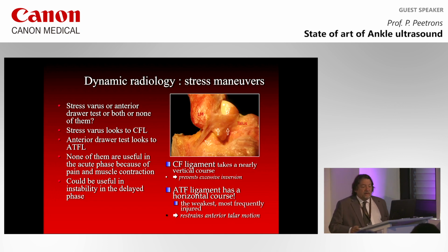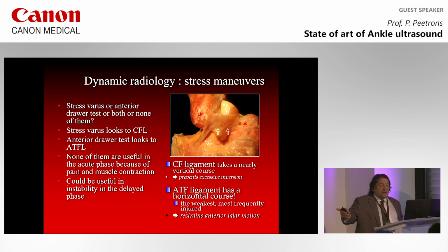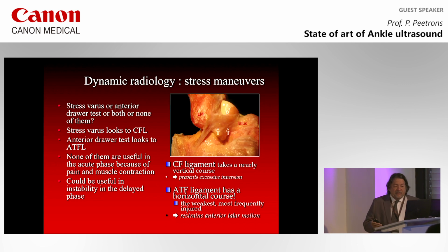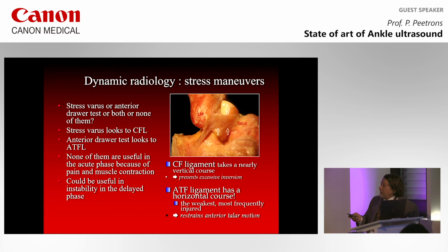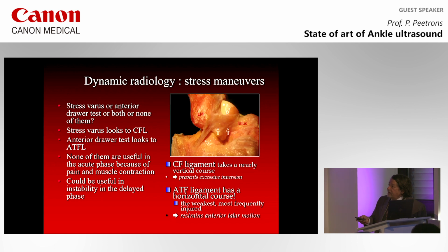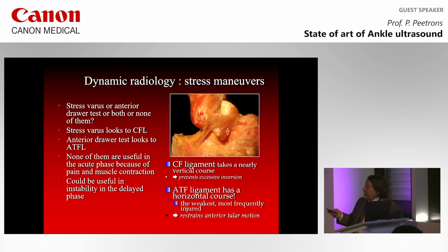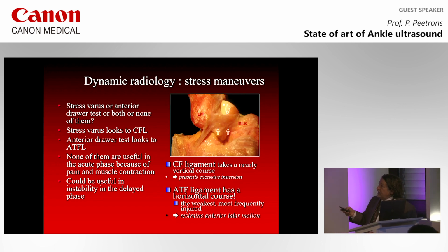So I will show you now the stress maneuver that we can use to see the lesion of the ATFL. And you all know that stress varus looks at the CFL, and the anterior drawer test looks at the ATFL. The anterior drawer test is very used in radiology, but we can do it also with ultrasound. Don't forget that the ATFL has a horizontal course like this, coming from the fibula and going to the talus. So when we do the anterior drawer test, we will see movements between the talus and the fibula.